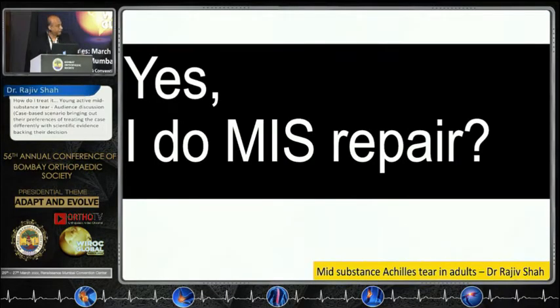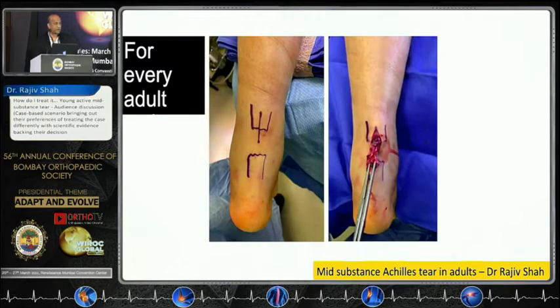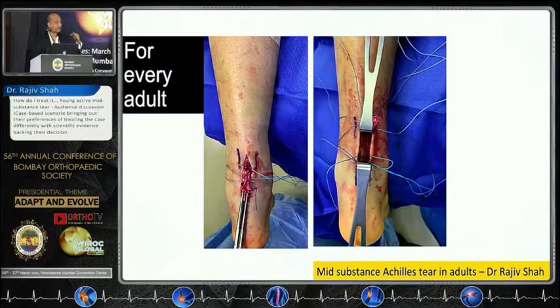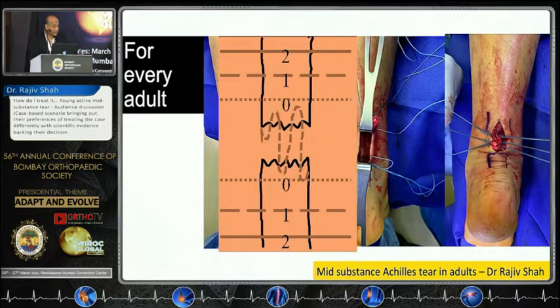So I do minimally invasive repair in an adult patient who comes with a mid-substance tendon Achilles tear. For every adult, I mark out the ruptured ends of the tendon and I mark out my vertical incision. I put in a vertical incision, I go into the paratenon, and with the Ellis forceps I pull out the tendon, and I pass 3 locking sutures like the ones you get through the PARS assembly. And with that I also pass 3 locking sutures into the distal end of the tendon, and then I tie it at the junction. This has worked well for every adult whom I have treated, and this is how the diagrammatic representation of this repair looks.